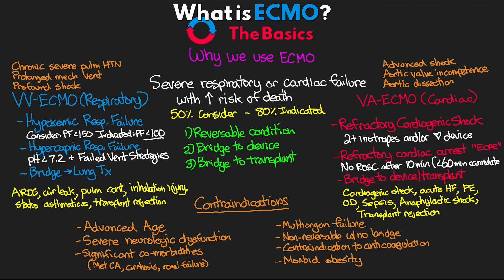So those are the reasons and why we would be using ECMO. Hopefully that, combined with talking through the circuit and the different configurations, makes sense. Why would we be using it? How would we be using it? And in what conditions we would find our patients that this would be potentially beneficial or would really prevent them from being able to get this therapy.